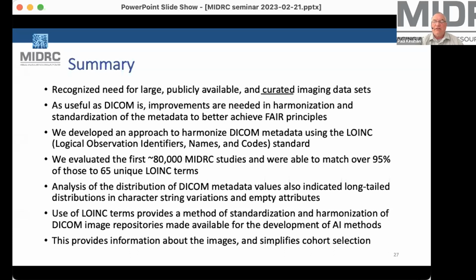So one of the things MIDRC is deliberately including is things that were the early indicators or concerns. So we're looking at MRI specifically, with the intent on neuro images and cardiac images as well, to start getting that up to speed. And so we're just expanding the data dictionary to include the key terms for MRI data acquisition right now.